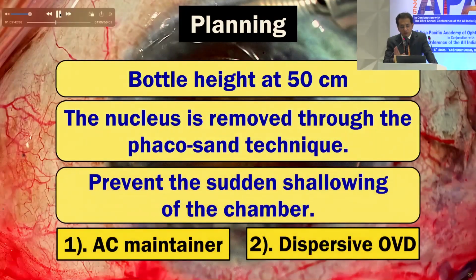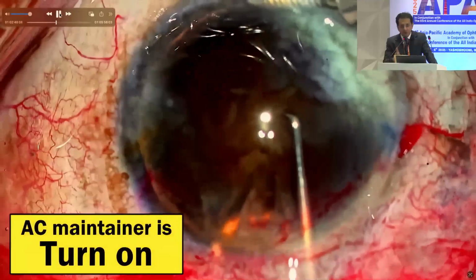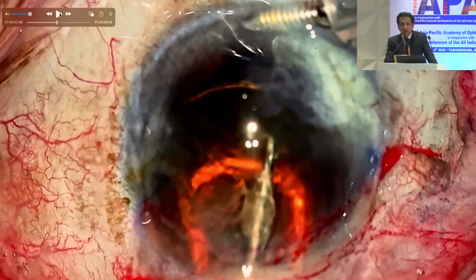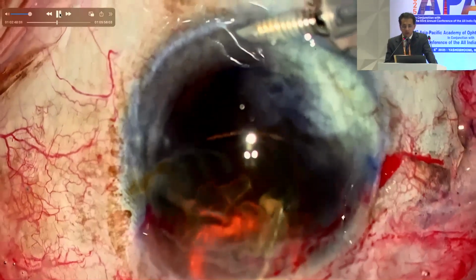So the bottle is kept at 50 centimeters, and it is on only at this stage when you're trying to prolapse the nucleus out. The traditional way of maneuvering the nucleus out with an AC maintainer is to just press on the scleral lip and it has to pop out. But that cannot be used in this posterior polar cataract, because that increased hydrostatic pressure itself can blow out the posterior capsule. So you're using a phaco sandwich technique with OVD, but you're also turning on the AC maintainer.